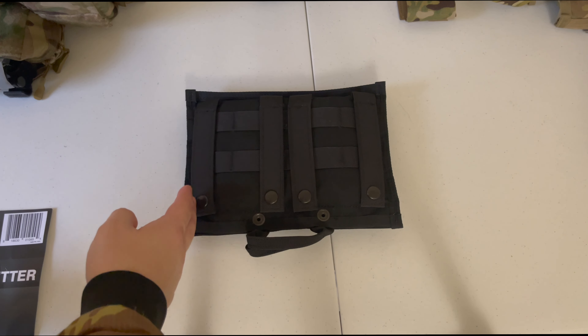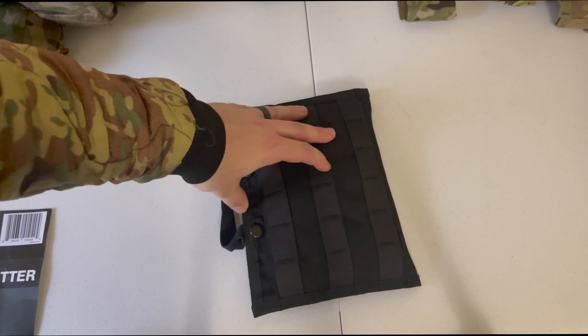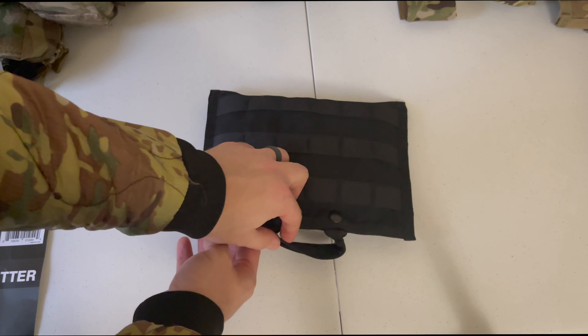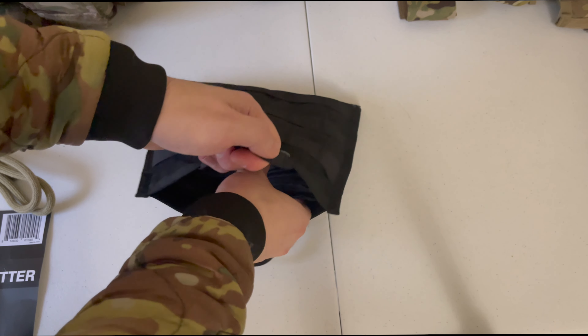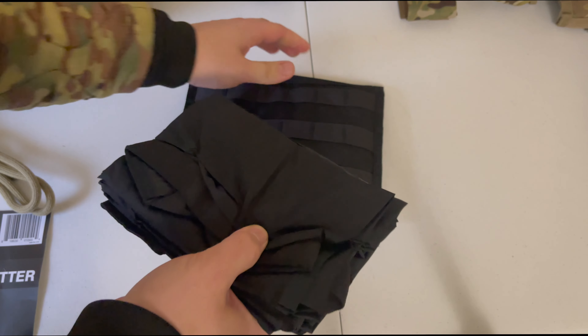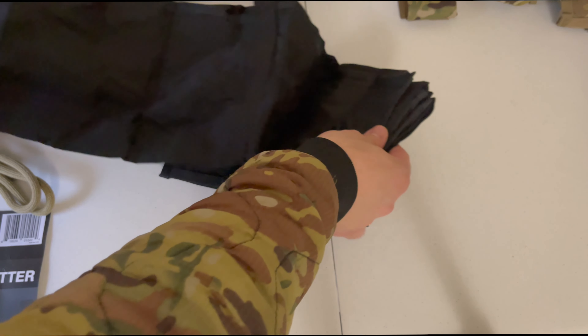The TaqMed Solutions Phantom Litter is an 8-column MOLLE that you can see here. It comes in a pattern of colors — this one is obviously in black. The way that you deploy this system is just a rapid pull: you pull it open in the back and then the litter deploys out like so.